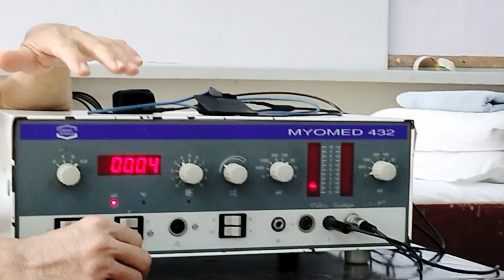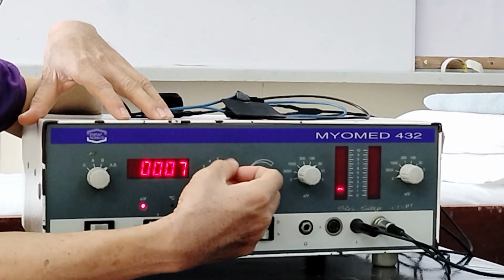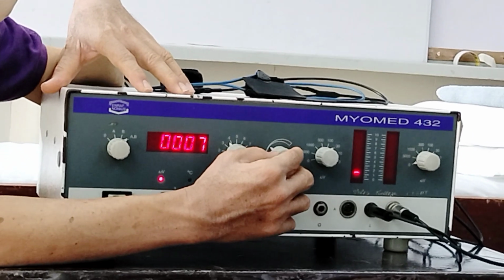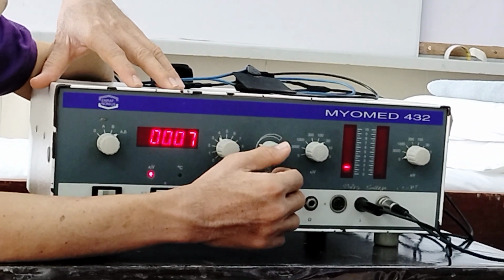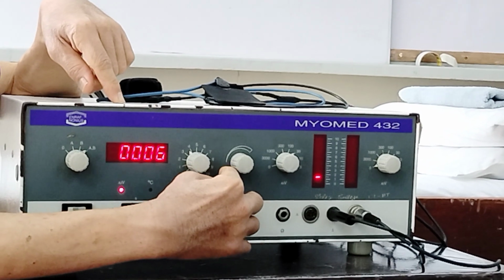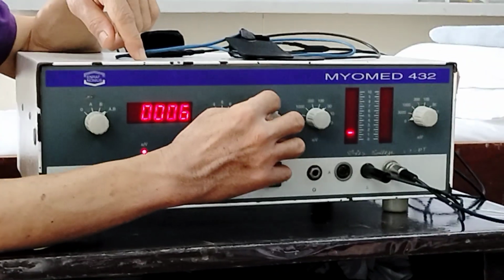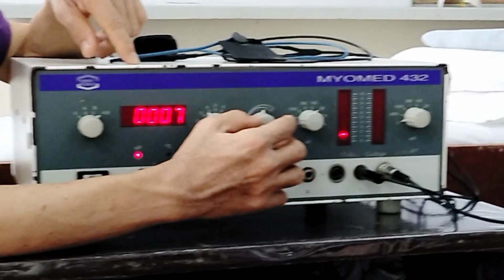Okay, so next here, we'll discuss that one later. This one adjusts the volume of the auditory or audio signal. Turning it counterclockwise, towards the pointed end, will reduce the volume. Turning it clockwise, towards the wide end, means increasing the volume.